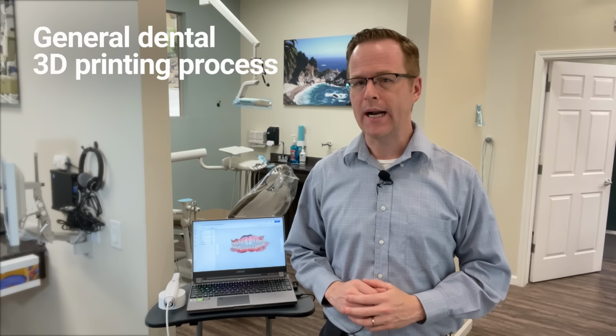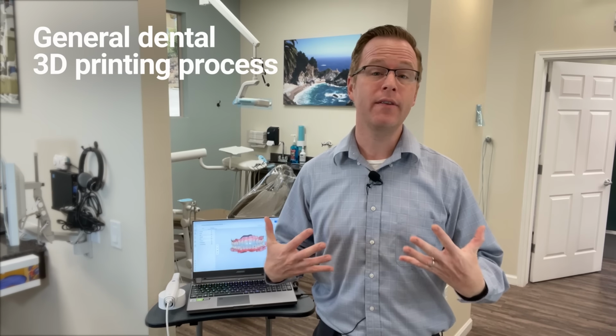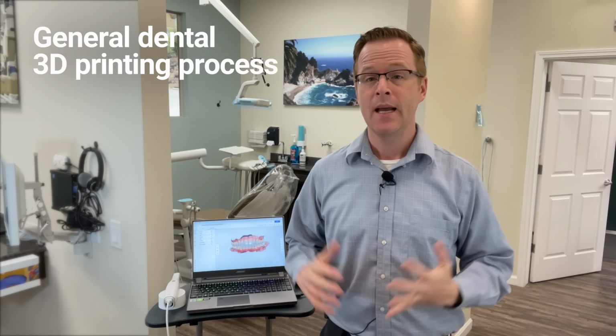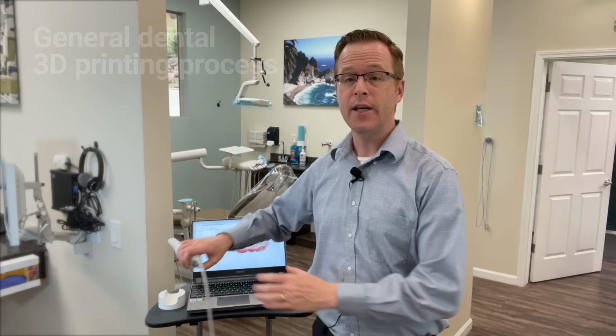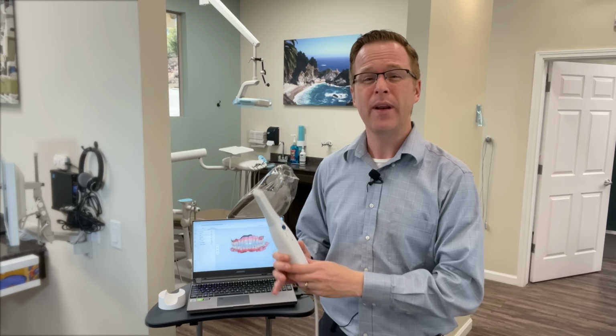Often in our clinical practice, when we're utilizing digital technology, we're always looking for a variety of different options that allow us to be more efficient in our clinical practice. Many times when we're thinking about utilizing something like an intraoral scanner, such as the Medit i700 scanner, we're presented with a patient in our office where we want to go ahead and routinely and predictably make a quick dental model for the patient.